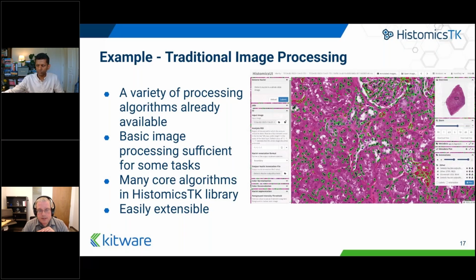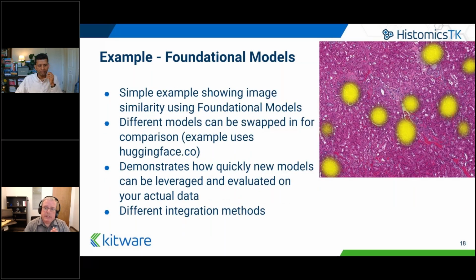And there's a plugin that you can upload to the system and say, hey, I'd like to expose the detect nuclei algorithm, and I'm going to pick this slide and set a few parameters. If you had particularly small or particularly large nuclei, maybe you have to adjust something, but it's intended to work at a certain scale.